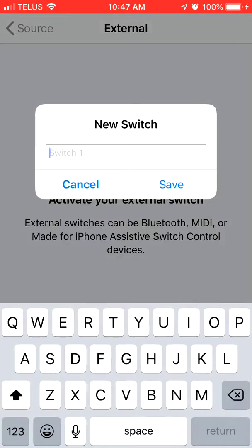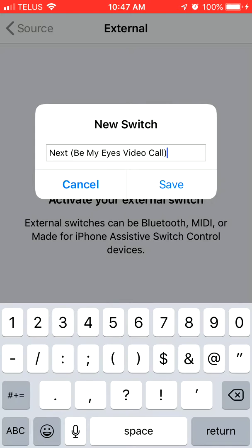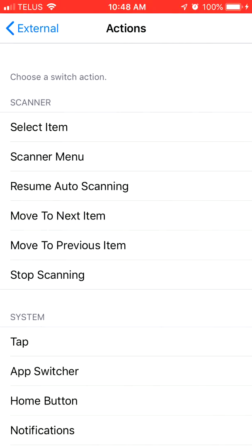In this case, we're going to label this switch Next, as that is the next switch. And in brackets, we're going to give it its alternative function, which in this case is Be My Eyes video call. And save that. And the reason we're naming it Be My Eyes video call is because one of its alternative functions will be to activate an app called Be My Eyes, which is a live video call app that allows visually impaired users to connect with a community of sighted volunteers to help them navigate certain things, whether it's checking the expiry date on a carton of milk or deciding what color shirt to wear.